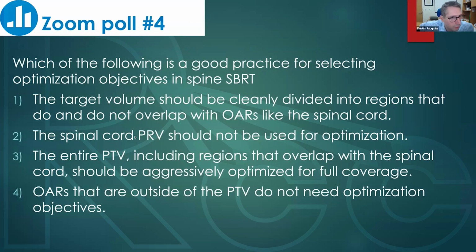All right, let's do poll question number 4. Which of the following is a good practice for selecting optimization objectives in spine SBRT?